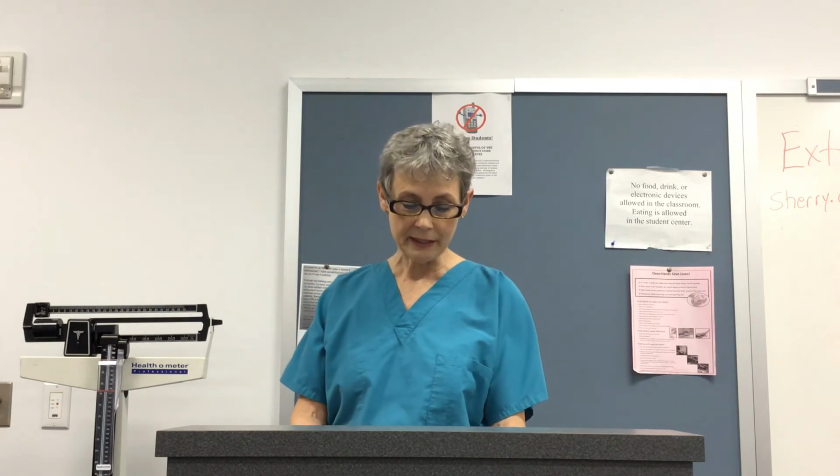And all you do is go in there and touch that IV just a little bit, and there it goes, back infusing just fine. And you put a little more reinforcement tape on it, you leave the room, and in about 15 minutes you're going to hear it again. So it's very frustrating to try to maintain a positional IV.